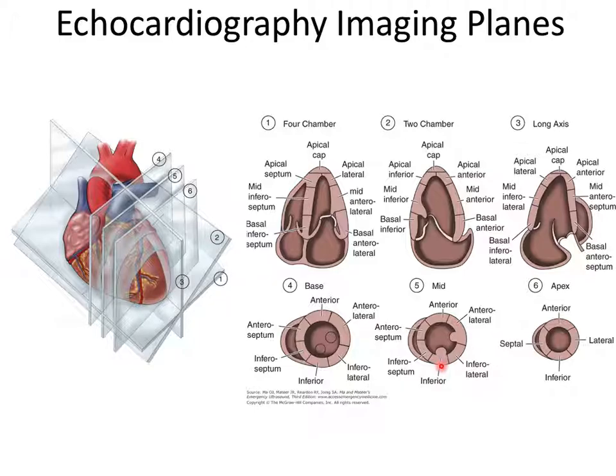And the reason they're cut into these big chunks and labeled is usually when you're looking at flow deficits, the resolution that you measure those flow deficits is kind of on the scale of these chunks. And that's historically from nuclear medicine, where the resolution is about the resolution of these chunks, right? And in MR and CT, and for a lot of echo machines, the resolution is much higher than this, but those chunks have traveled with cardiology for years and years, and people use them as their map coordinates.